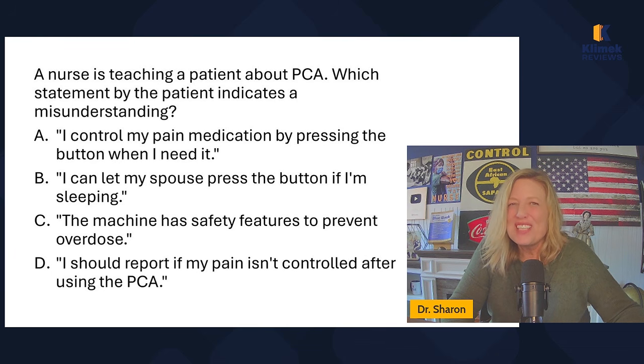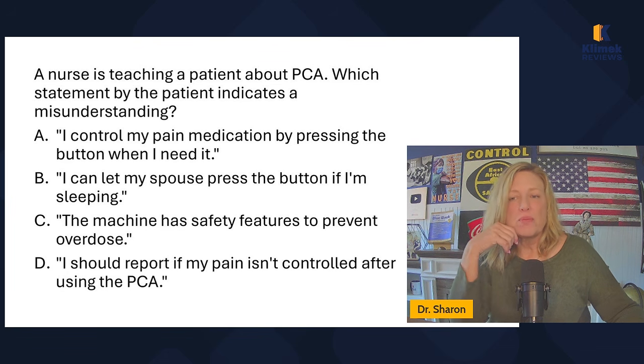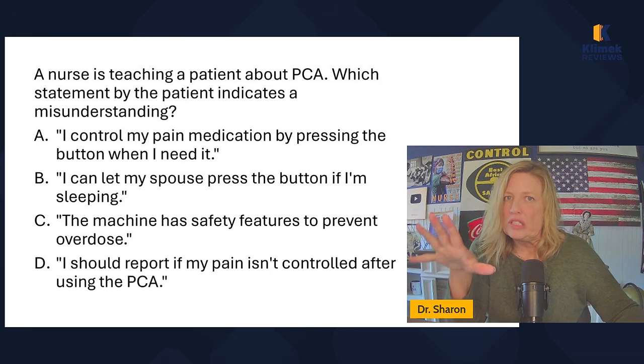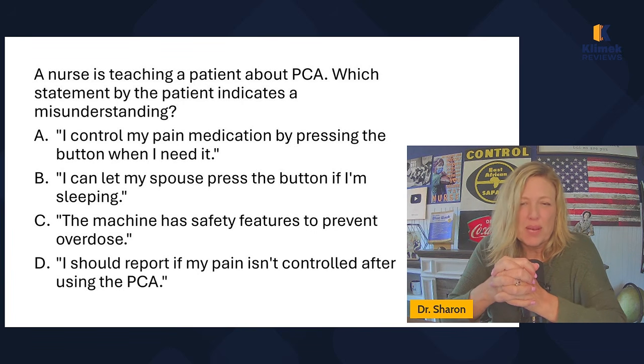They're not supposed to let their spouse. In fact, if you walk in and the spouse is pressing the pain medication, unless it's like a patient who's like, my hand hurts and I can't do it, if they're telling their spouse to press it, maybe. But if they can't physically do it, they shouldn't have it. The spouse is never supposed to press it. If you walk in the room, the spouse presses the button, you need to say something like, I'm sorry, you can't do that. We can't let that happen. So we may have to switch pain if the spouse is pushing the button.